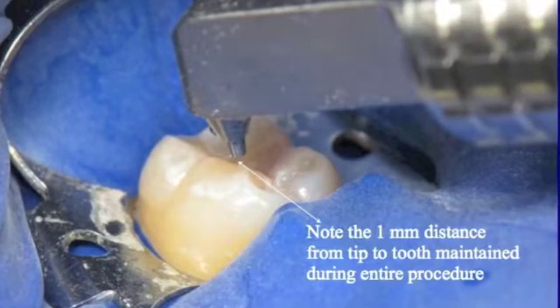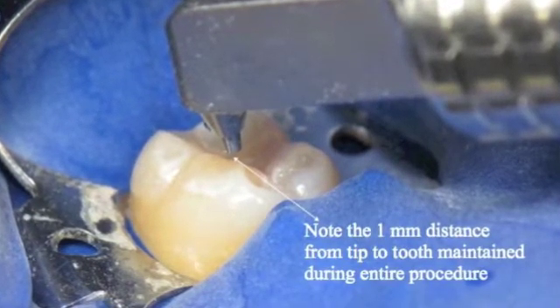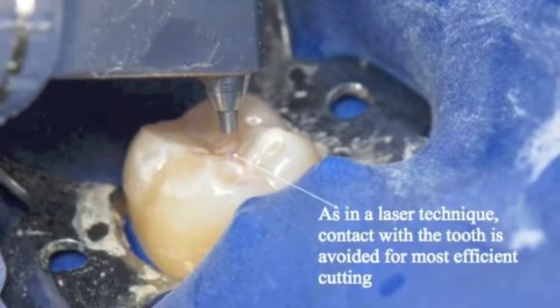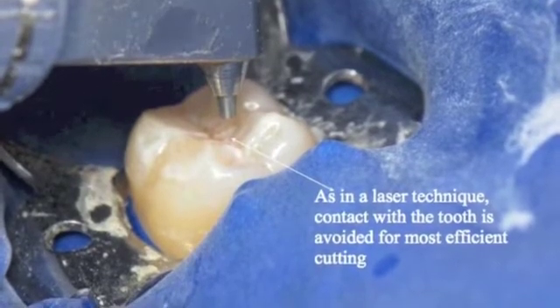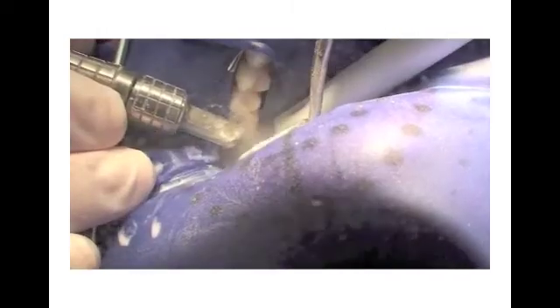The head of the air abrasion handpiece is held within a millimeter of the fissure and used in a brief, sweeping motion, applied over 2-3 seconds in the area to be inspected. The patient perceives the sensation of washing off the tooth. Have your dental assistant hold the high-speed suction adjacent to the tooth being prepared. Air abrasion is a series of quick 2-3 second air blasts, and then a quick look process. When finished, place the handpiece back in the minute cradle on top of the unit.